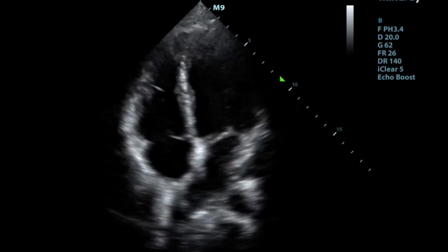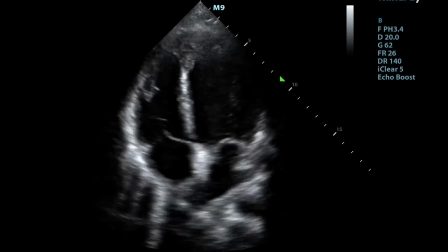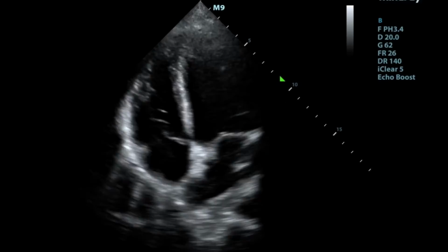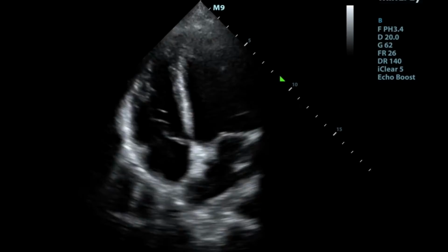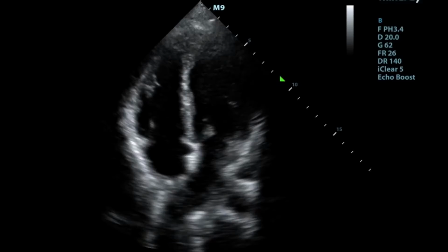So point-of-care ultrasound, we've been using it for a long time. So it's a great tool in patients. I'm not advocating to do point-of-care ultrasound in every intubation. The ones who don't look good, they're critically ill, whatever that is, so you don't have a good feel for them. They're on the edge. So they are the ones I think you definitely have to pick up the probe and scan prior to intubation.